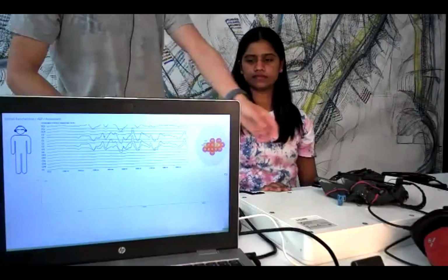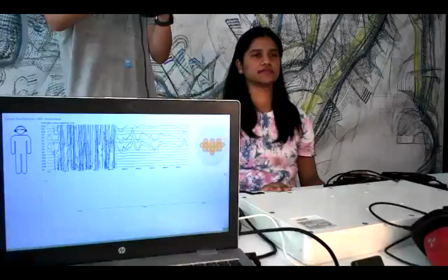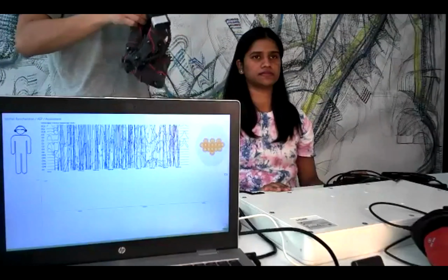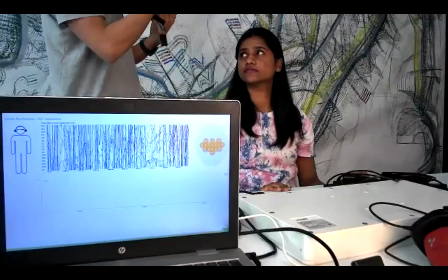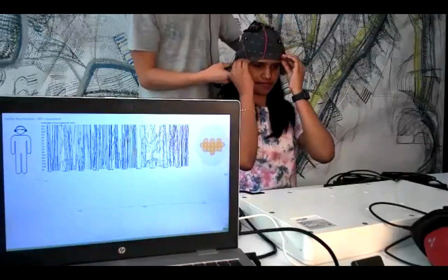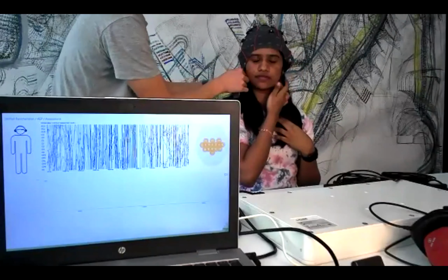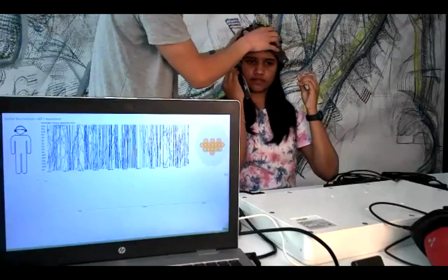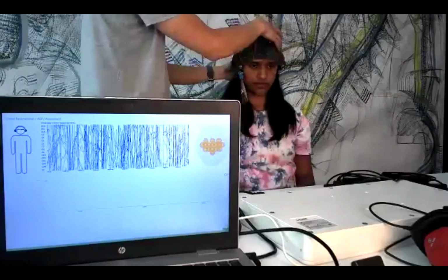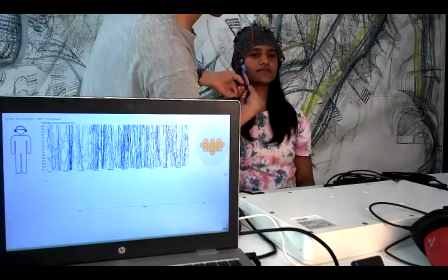So I'm going to put on the EEG cap. Just a little bit. Get the positions correct.